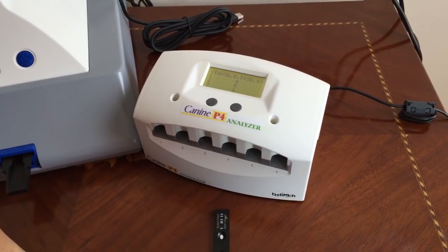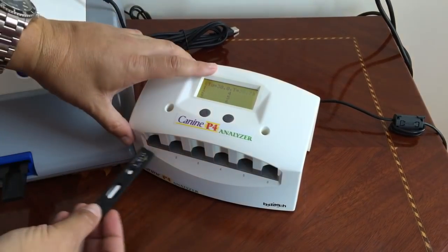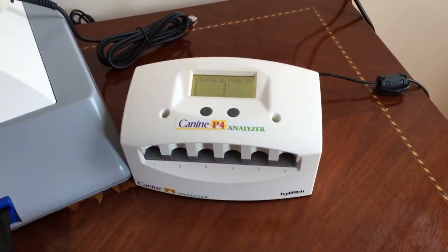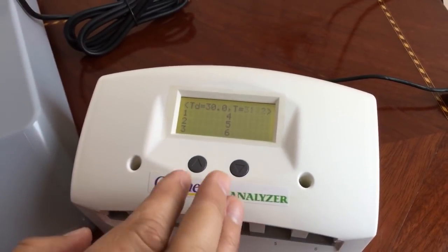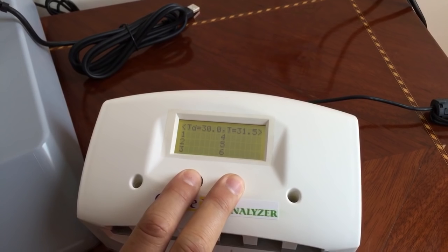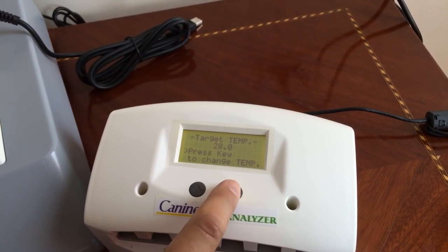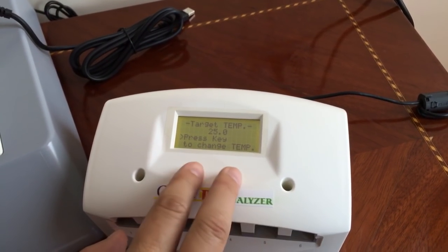Progesterone tests need to be at 25 Celsius, so with this machine we can do up to six strips at a time. We can set it up anywhere from 20 to 40 degrees. This is how you set it up — you press both buttons and this will take you to the temperature menu. We want to make it at 25 Celsius; that's the perfect temperature for progesterone.